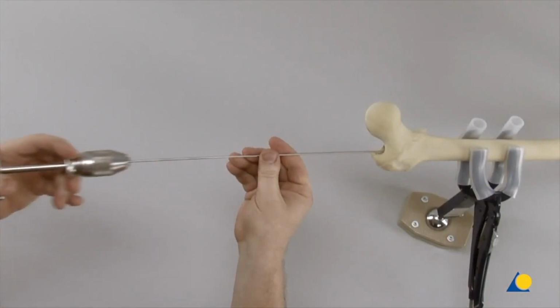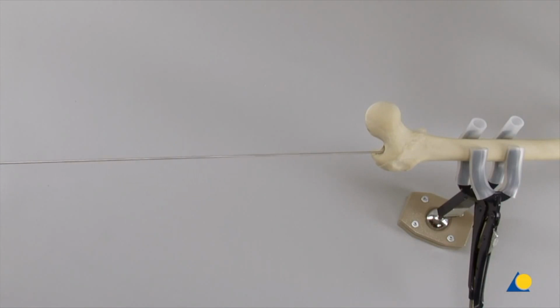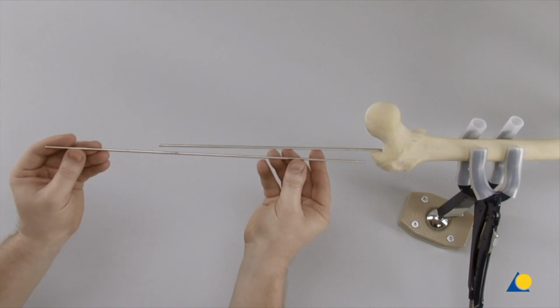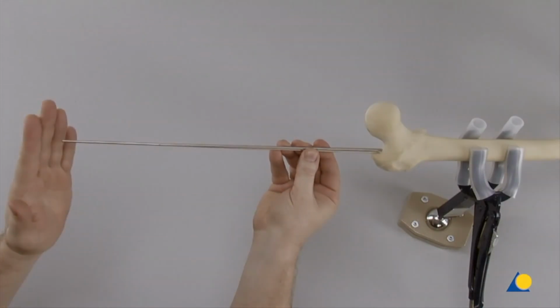The tip of the reaming rod is positioned under image intensification in both the AP and lateral planes in the center of the distal femoral condyle. This will prevent a valgus or varus deformity at the fracture zone. The approximate depth is gauged by placing a guide wire parallel to the inserted reaming rod at the bone.